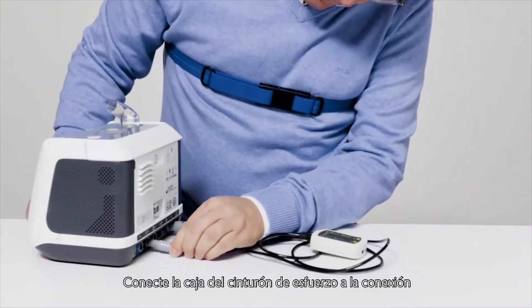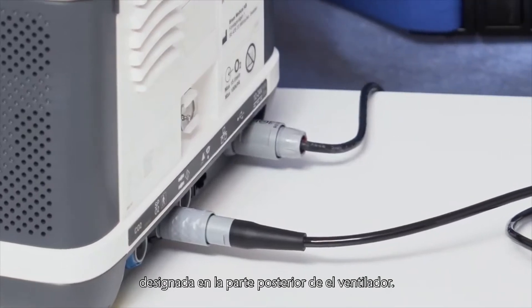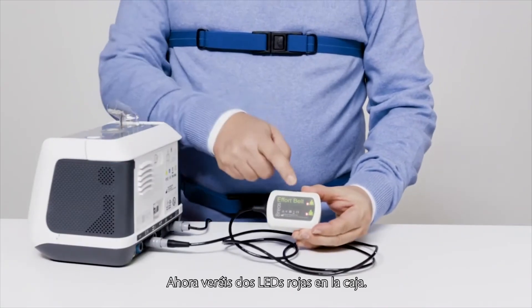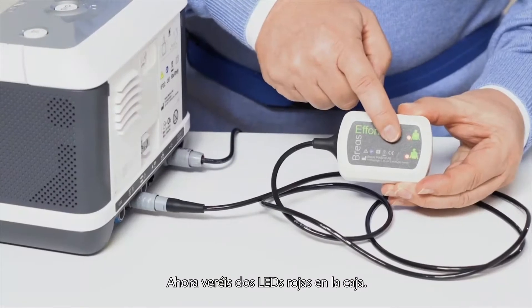Connect the effort belt box to the designated connection port on the backside of the ventilator. You will now see two red LEDs on the box.